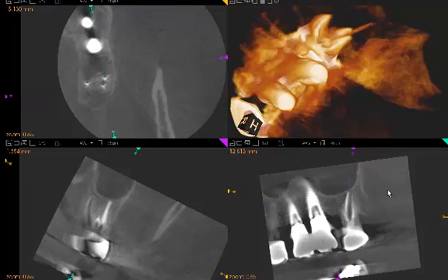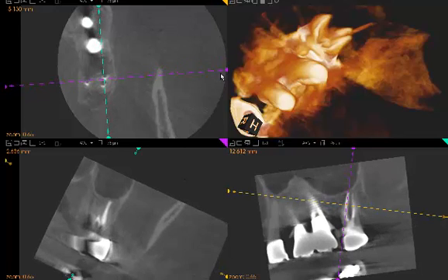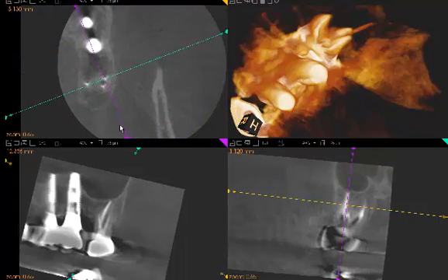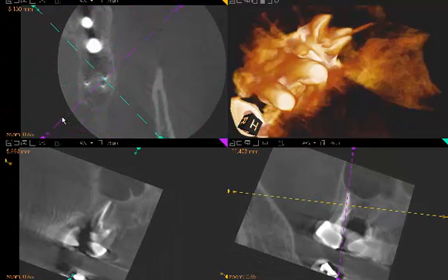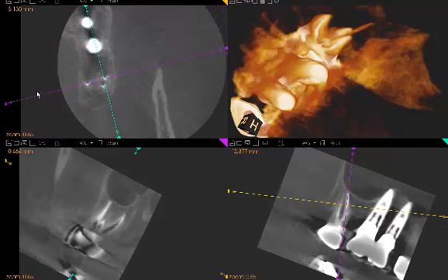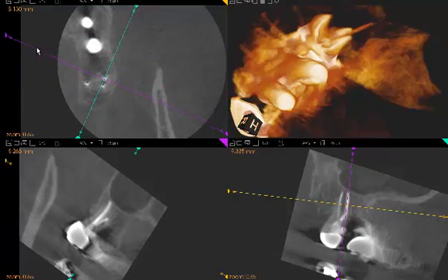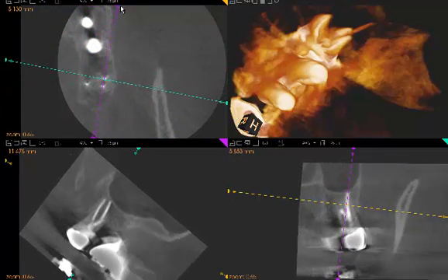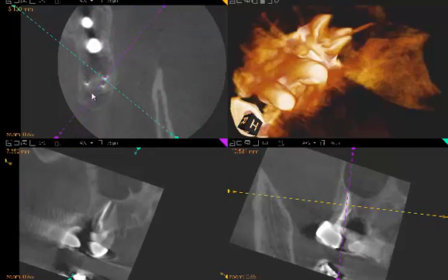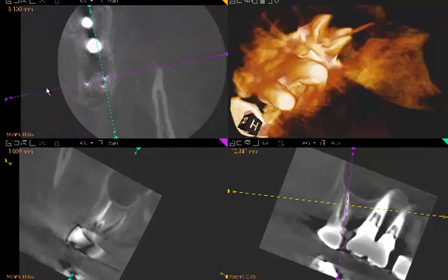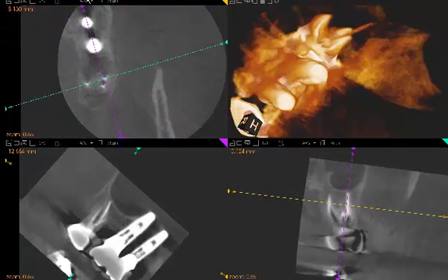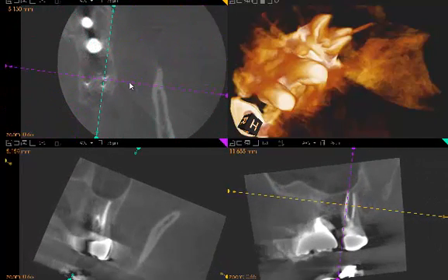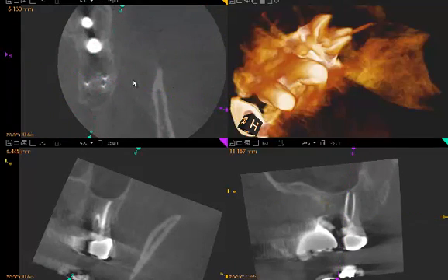As I rotate the plane along the apical half of the MB root, the periradicular bone also looks very good. There are no signs of radiolucency suggesting lesions or disease, and the sinus also looks clear in that area. The area that I was most perplexed about being perforated may be a very short mesiolingual root, or it may be perforated — it may have been so thin that I slid right through that area. On the 3D section, you can see that is a very narrow portion of the root. So it's either a small mesiolingual root, or possibly a perforation out of a very narrow section.